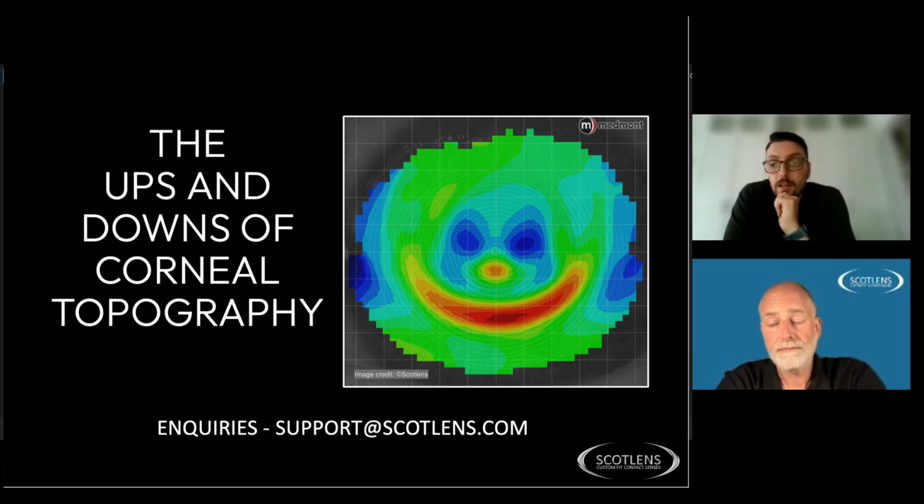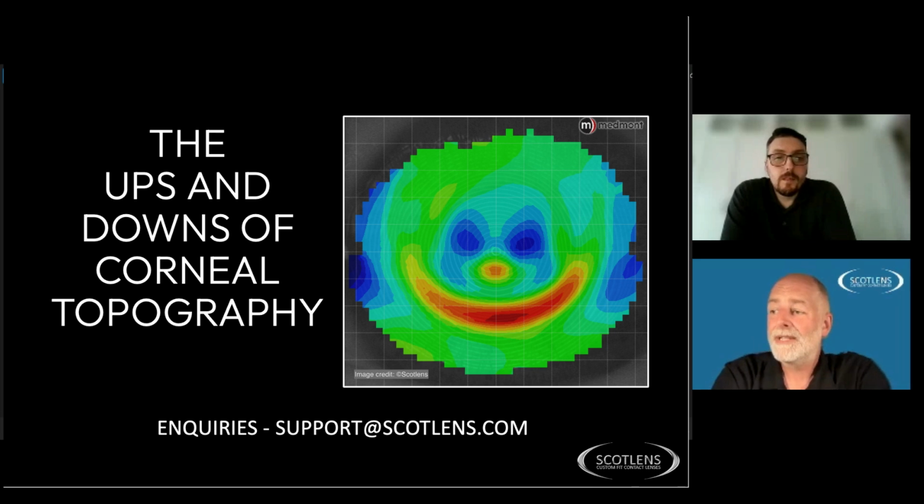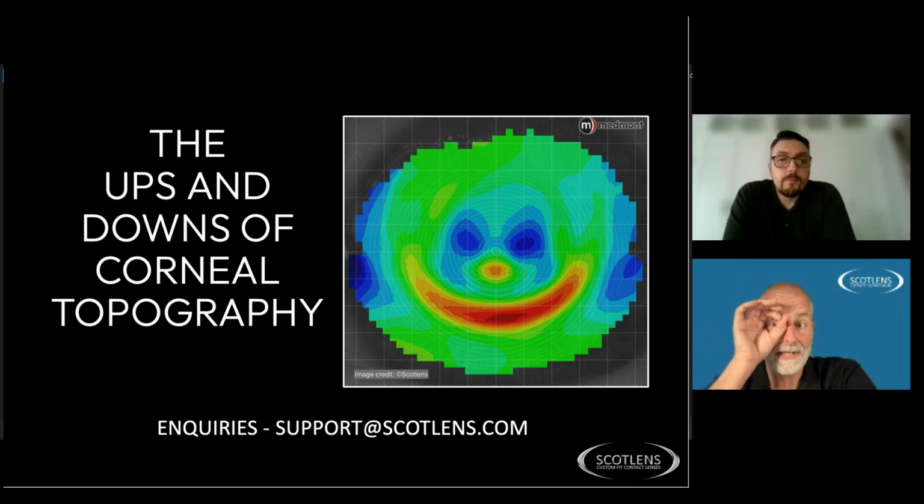Excellent, perfect. Last question: is a large cone topographer better for pediatric population compared to small cone topographer? No. It's that trade-off between accuracy from the first fit lenses you're going to get versus something not being quite as close to the patient's eye. Kids are quite excited. They just think they're looking down into a telescope, and you get all the rings. So kids are fine. It's the fidgeting of the kids that's the problem, and that's a good thing with the Medmont: it's a video capture, so it automatically screens the images and picks up better quality images.